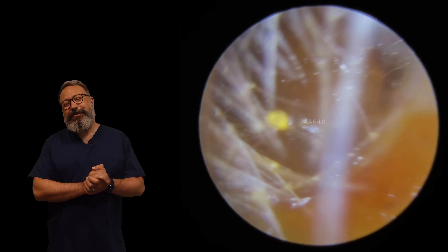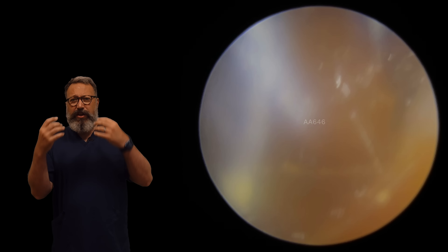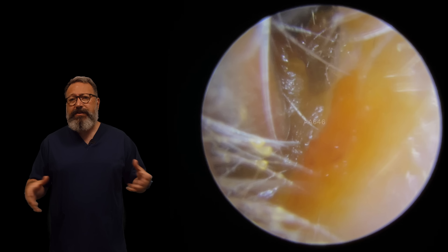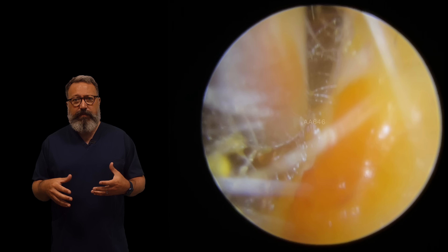Hi everybody, this is Rhys Barber from Audiology Associates. Thanks very much for watching our ear wax removal video today. You can see a really humid ear canal straight off here. We'll pop the suction tube in. That's going to clear some of the humidity, but you can also see we've got this very sticky type wax coming through.